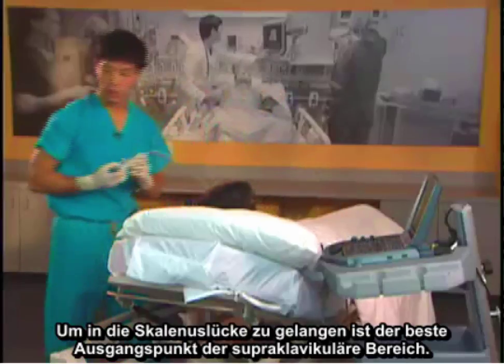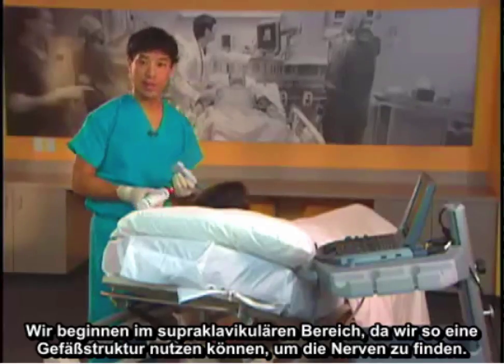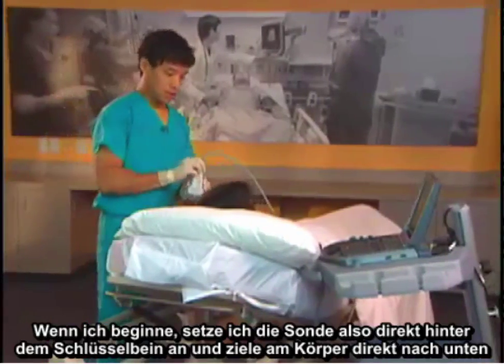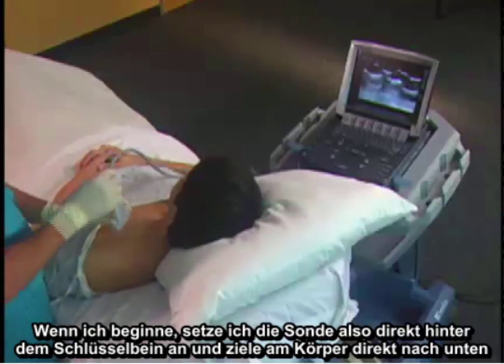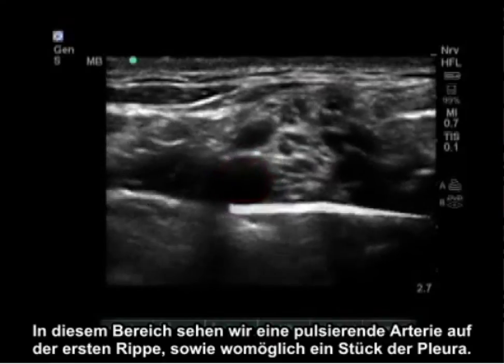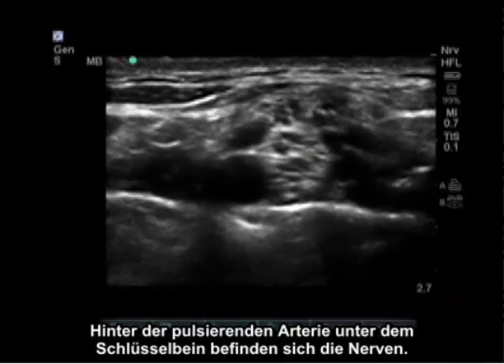To get to the interscalene groove, the best place to start is in the supraclavicular region. The reason we start there is that it allows us to use a vascular structure to find the nerves. I put the probe just posterior to the clavicle aiming straight down the body. In this area we will see a pulsating artery sitting on the first rib, as well as some pleura possibly.